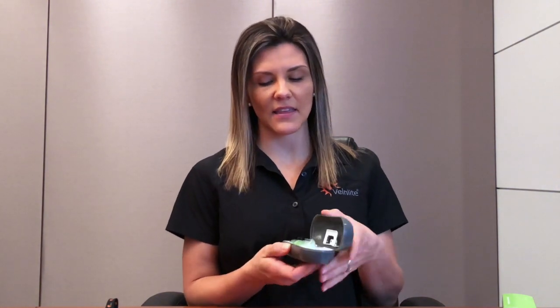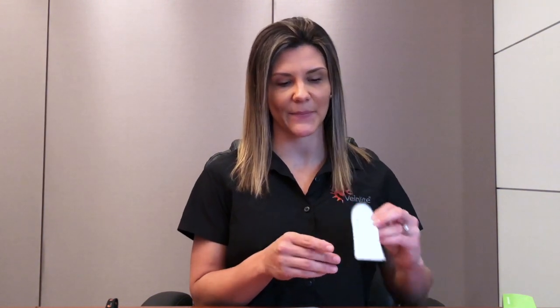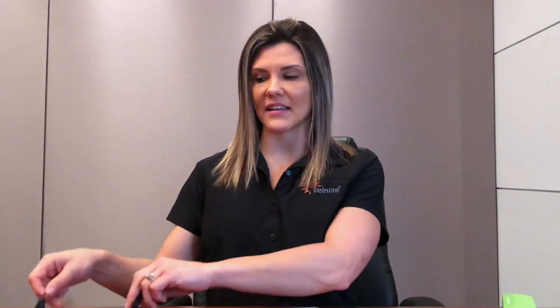Once you open your case, you will see that the Veinlight Neo comes with a AAA battery that powers the unit, the Neo itself, a protective end cap that doubles as a lanyard holder, and a pack of disposable plastic covers, which will protect your Veinlight Neo and prevent cross-contamination between patients. You may also purchase a lanyard as an accessory.